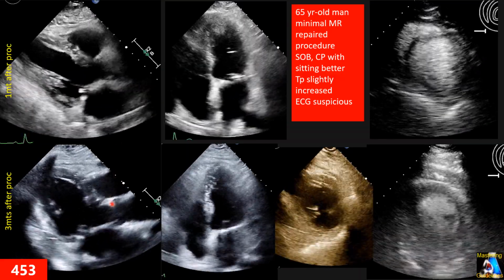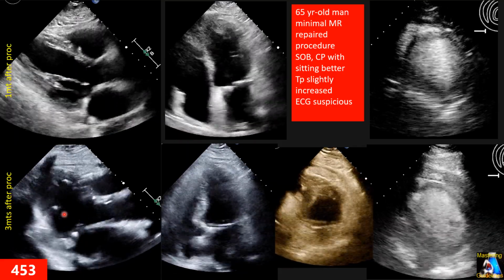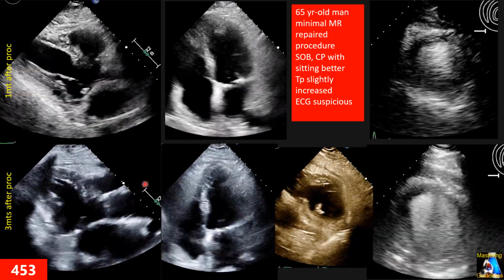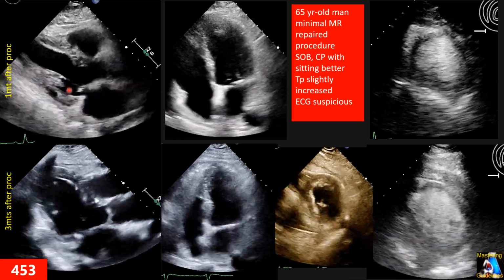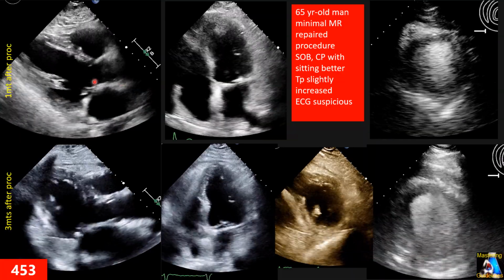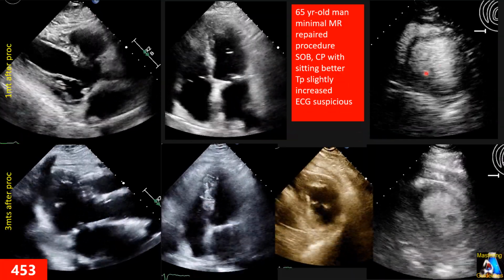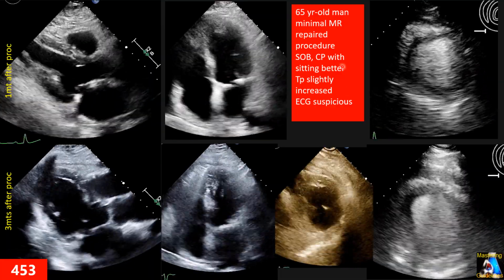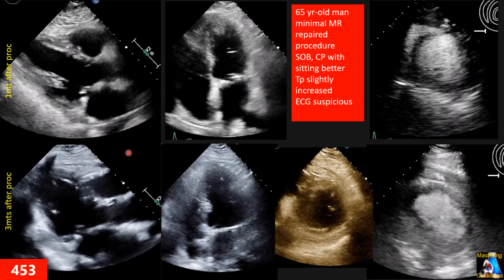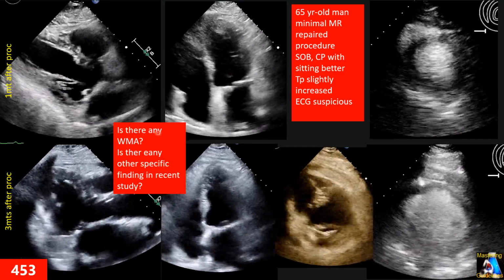Here we have the echo study, those 4 clips at the present time, almost 3 months after the procedure. And we have one follow-up echo 1 month after the procedure in the top row. I put them all together in the same windows so you can compare them to each other. First of all, as you can see, there is some specific wall motion abnormality.